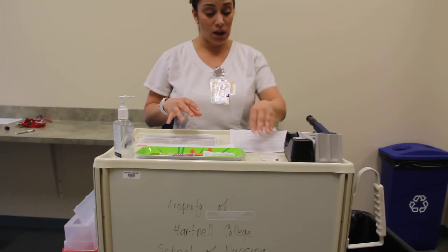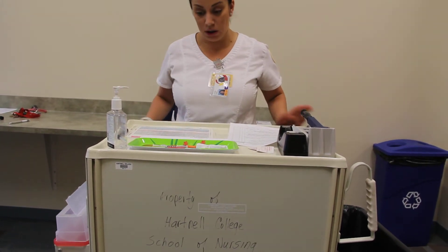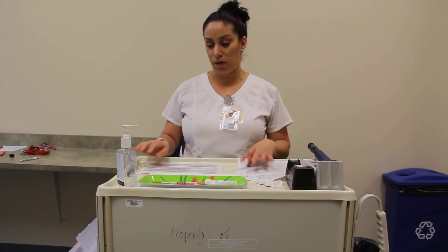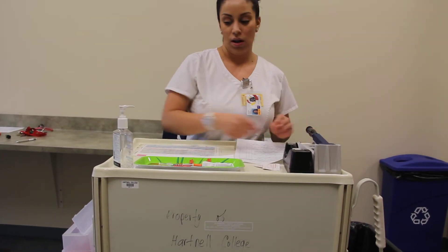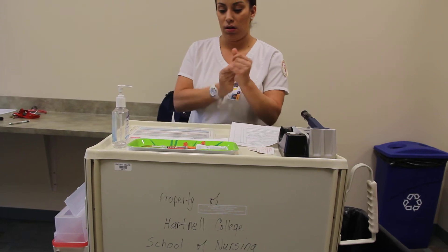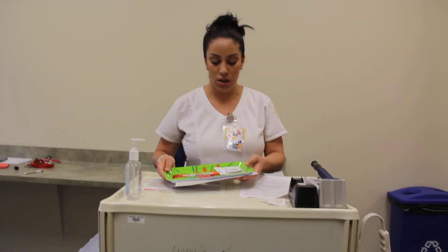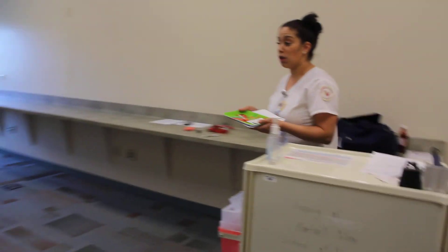I'm going to clean up everything here. Most importantly, I'm going to lock my cart, make sure everything is locked and put away — don't leave anything out. I can wash my hands one more time. I'm ready to administer my insulin to my patient, so I'm going to leave and go to my patient's room.